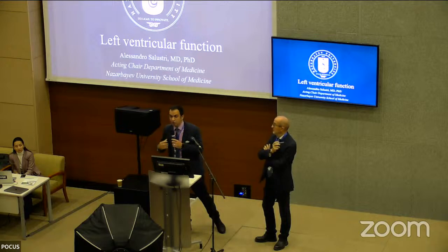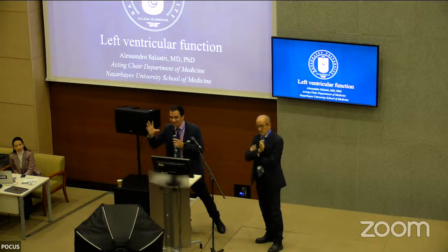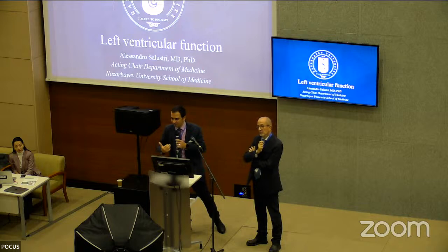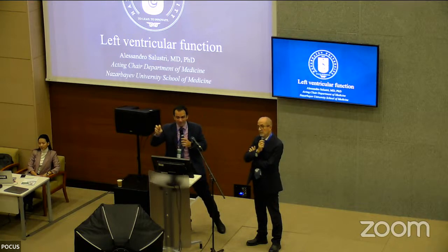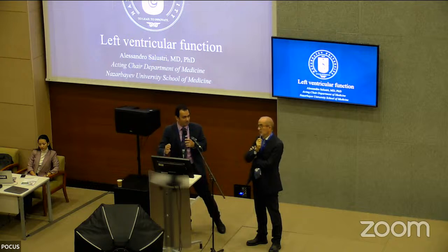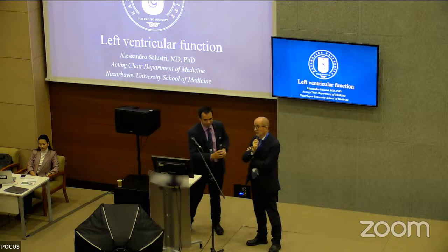What if there is an acute mitral regurgitation? Patient with papillary muscle rupture, acute mitral regurg, you will see super high ejection fraction, but the blood is going backwards with systole. So the amount of shortening of the LV cavity does not necessarily indicate how much blood is going across the aortic valve to provide perfusion. That's what I wanted to add.